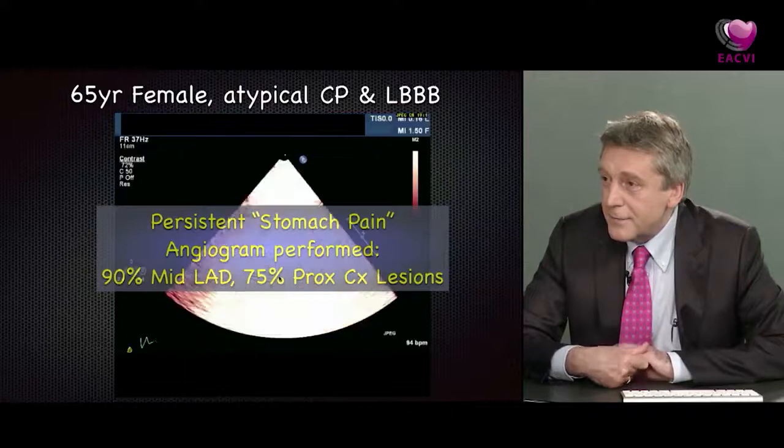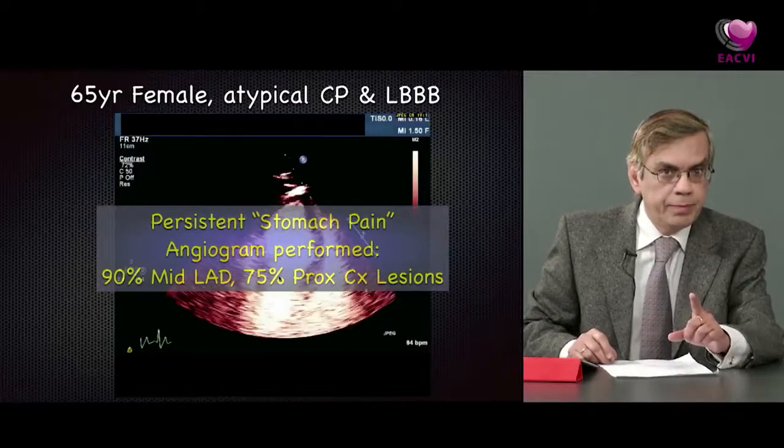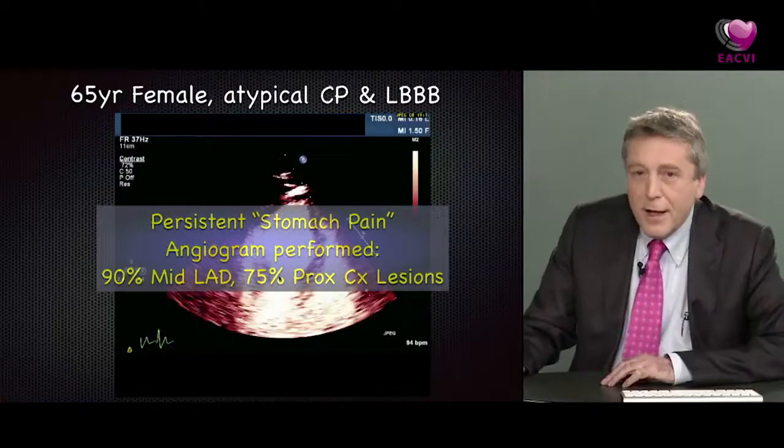And also, you can see from your image that there's an apical defect and your focus is towards the apex, so that's a true defect. Yes, absolutely. Yep. Okay.